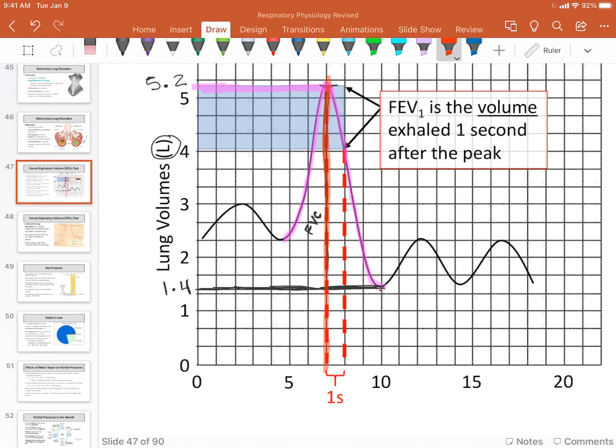You're going to see that that's approximately 5, 6, 7 seconds, so that would be 7 seconds on my timeline. But I'm actually going to reset the scale and say 7 seconds equals my brand new zero. The next line I will place at exactly one second away from the peak. And the trick here is to line up the first, the zero mark at the point on the peak where the volume starts to decrease.